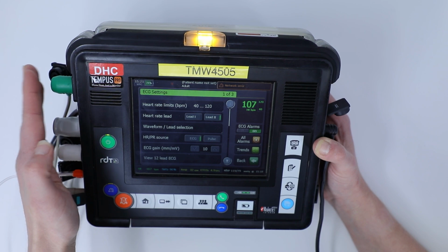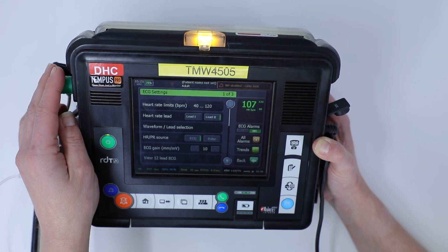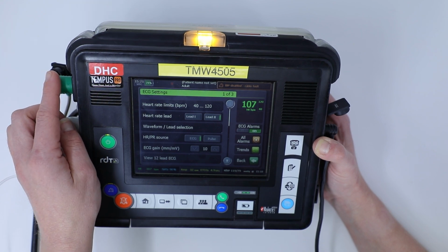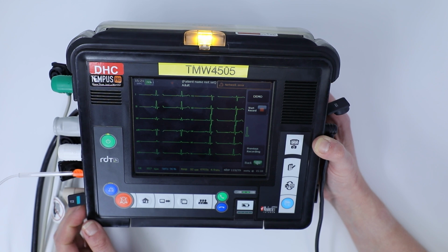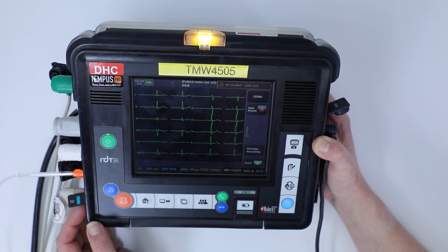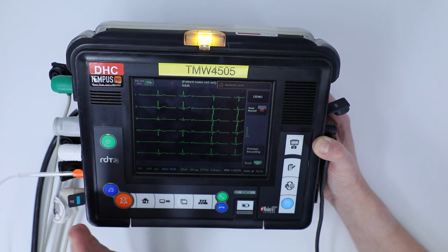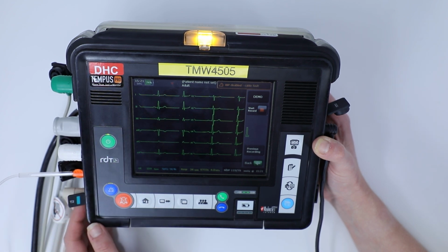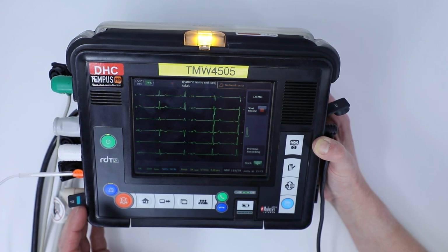So for the purposes of this then, we've connected our 12-lead ECG. Normally the patient's on their 5-lead, but we've got a 12-lead ECG here, and I'm going to click View. And now you can see the screen has changed, so we've got what you would normally be used to seeing as a 12-lead ECG. Obviously we can have a look at that on the screen, so if you had a patient who had chest pain or anything clinically indicating of a 12-lead ECG, you can see what's going on.